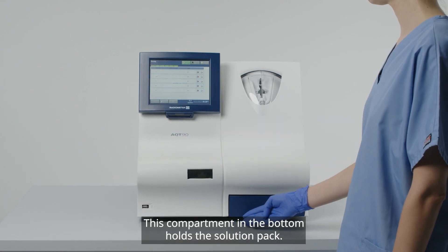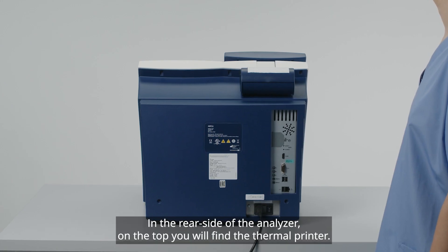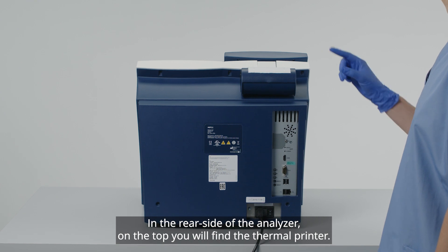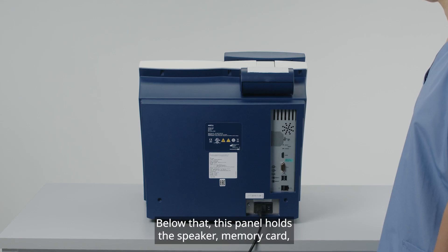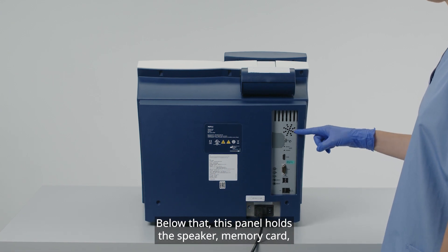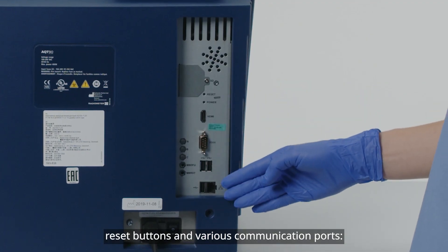This compartment in the bottom holds the solution pack. In the rear side of the analyzer, on the top, you will find the thermal printer. Below that, this panel holds the speaker, memory card, reset buttons, and various communication ports.